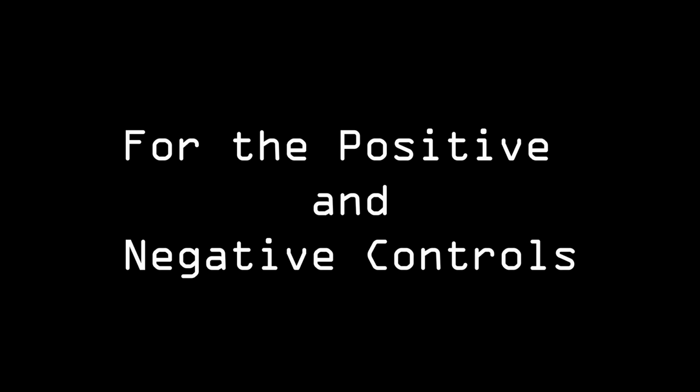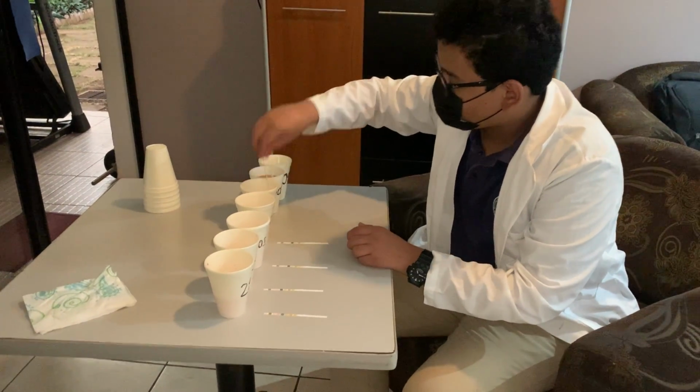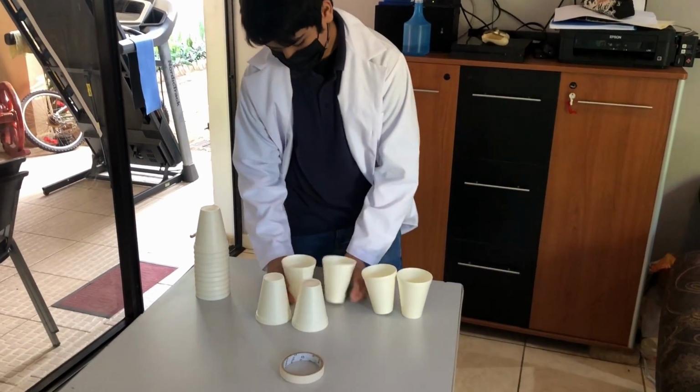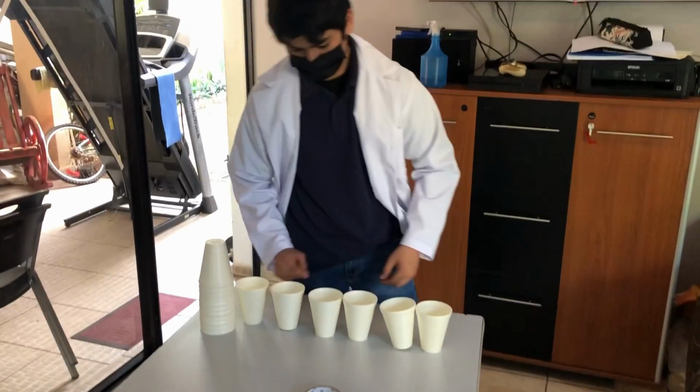Now, to start with this experiment, we must first determine whether the urinalysis test strips actually work. To do this, we must make a positive control group to test the levels of glucose intensity and see if the test strips provide accurate results.